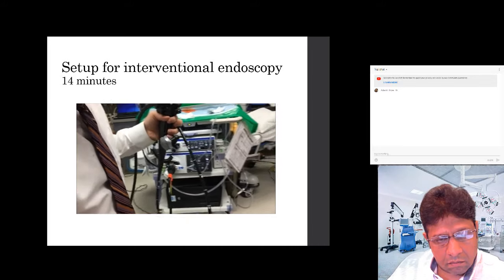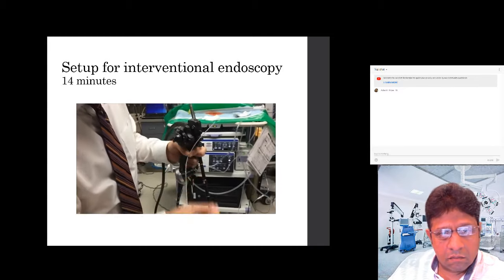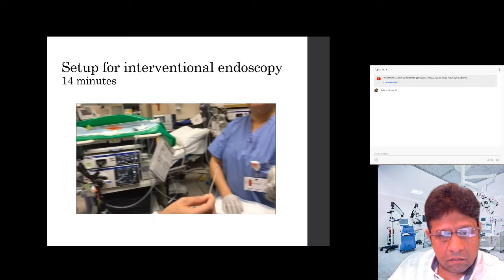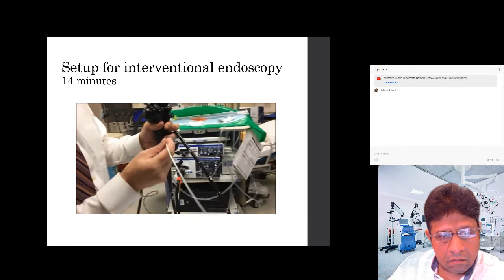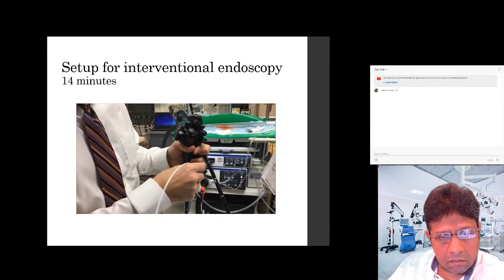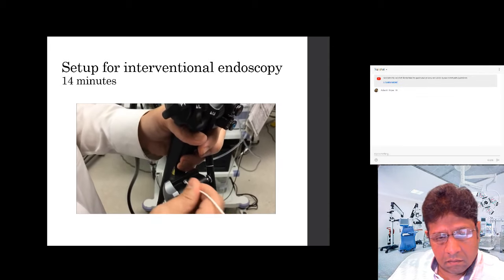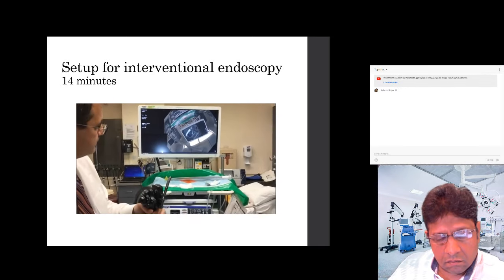Okay. Then you have this tool that just loads the string through the scope. They're both exactly the same on both sides. They have little hooks on both ends, right? So basically you take this and pass it through there, and just pass it till it comes out the end, through the hole we punctured. Yep, right through the hole. And ultimately it's going to come through the end.